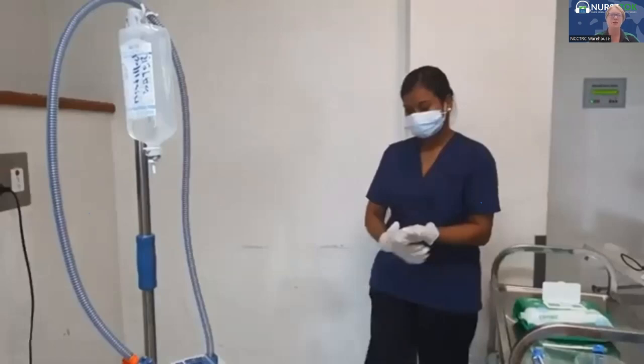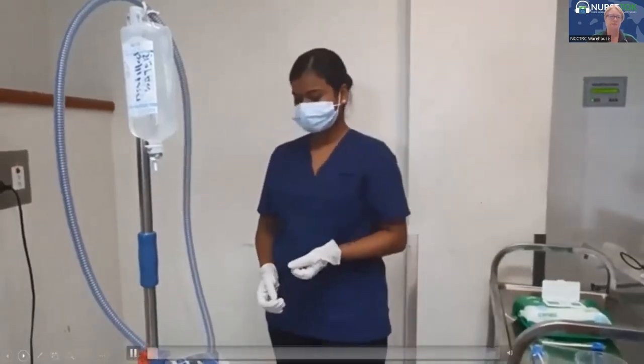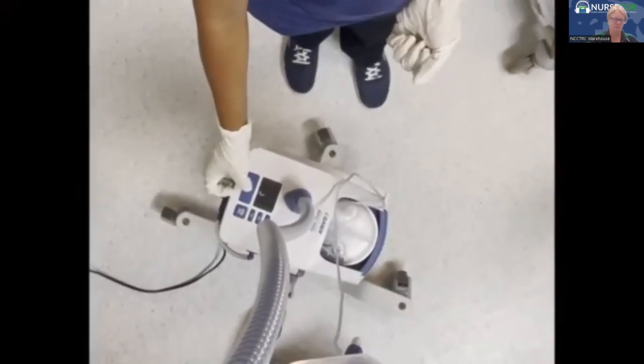All right. So this is the final video, and this is about how to disinfect the EVO after your patient has finished using it. Okay. Clean and disinfect the EVO 2. Switch off the machine, unplug from the mains.